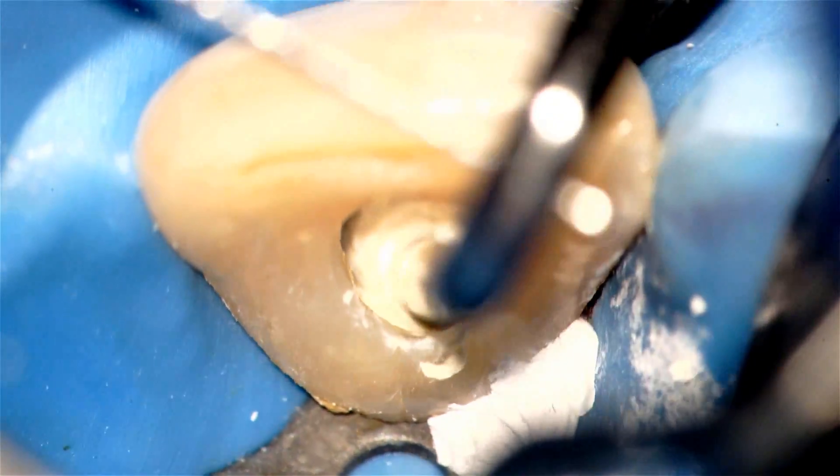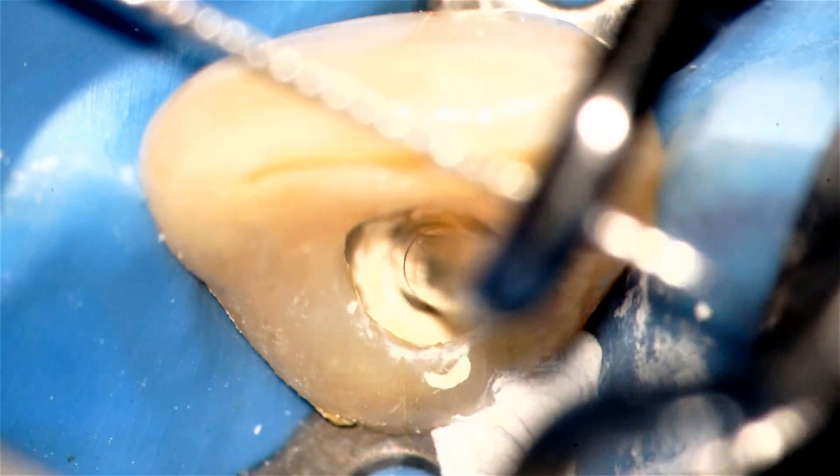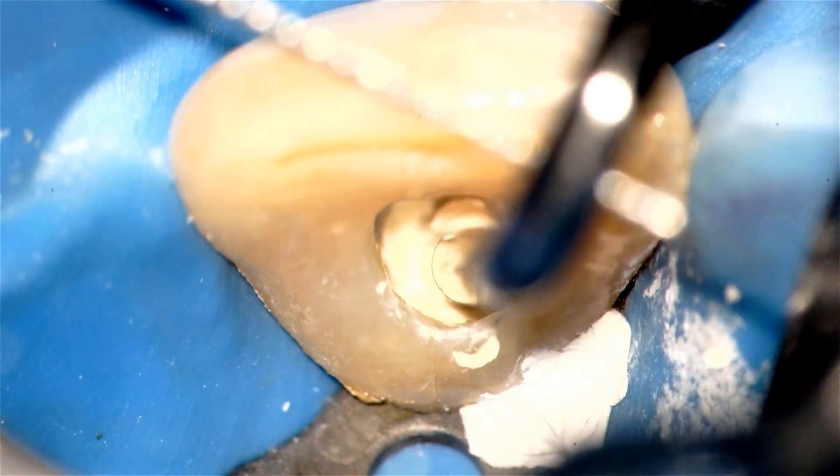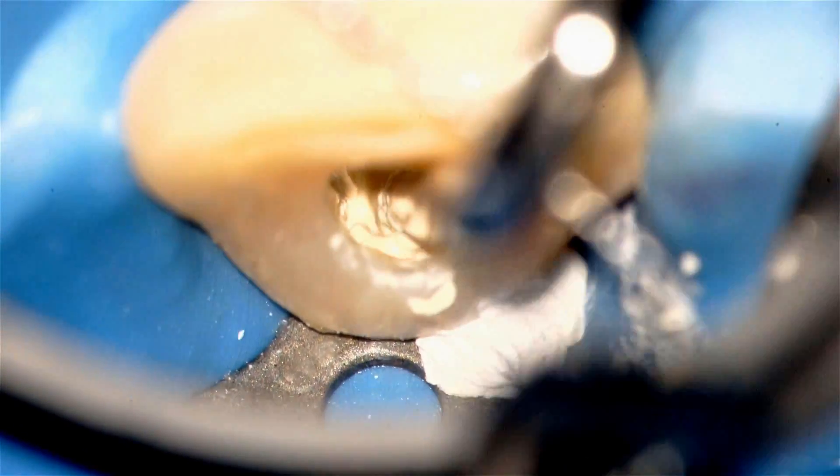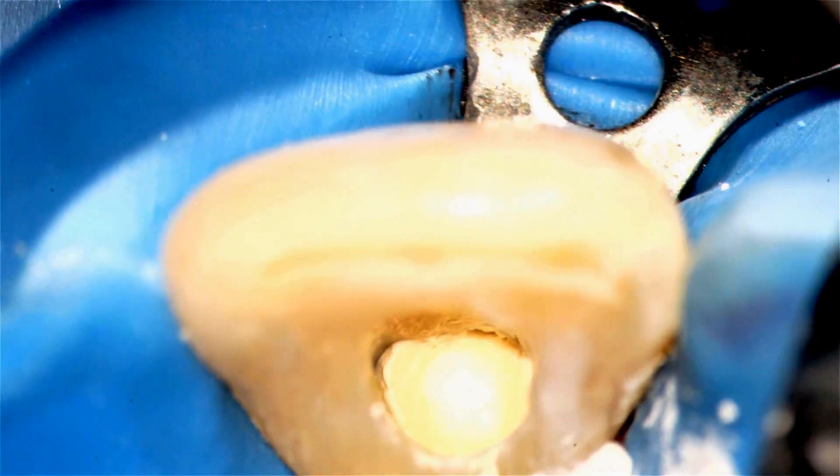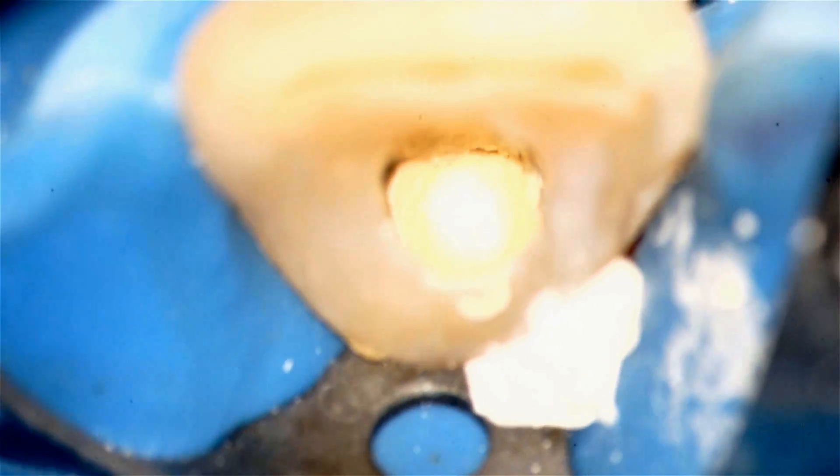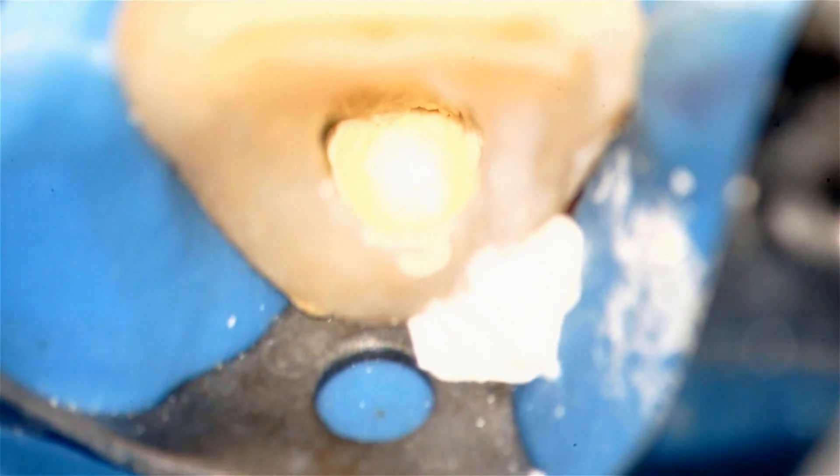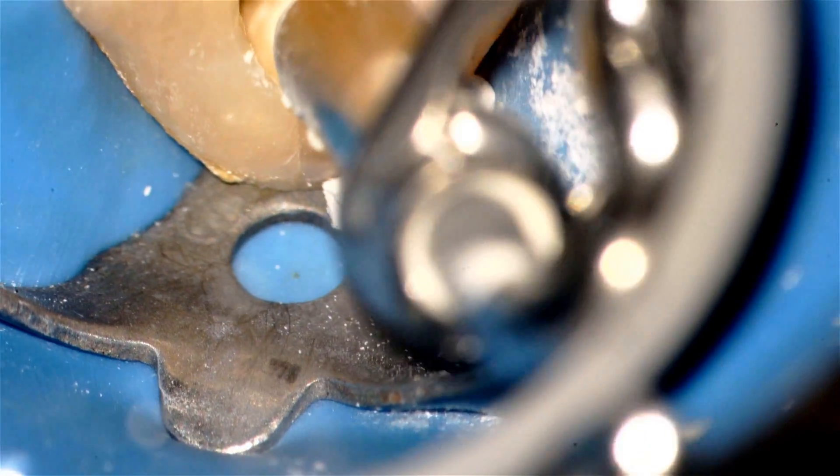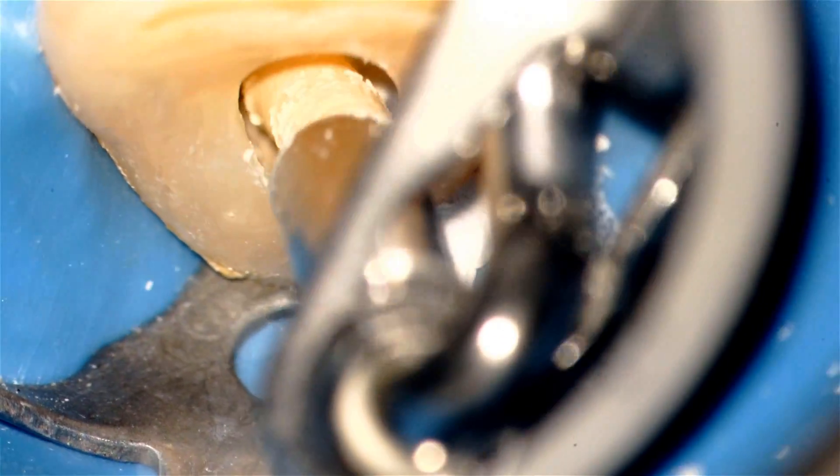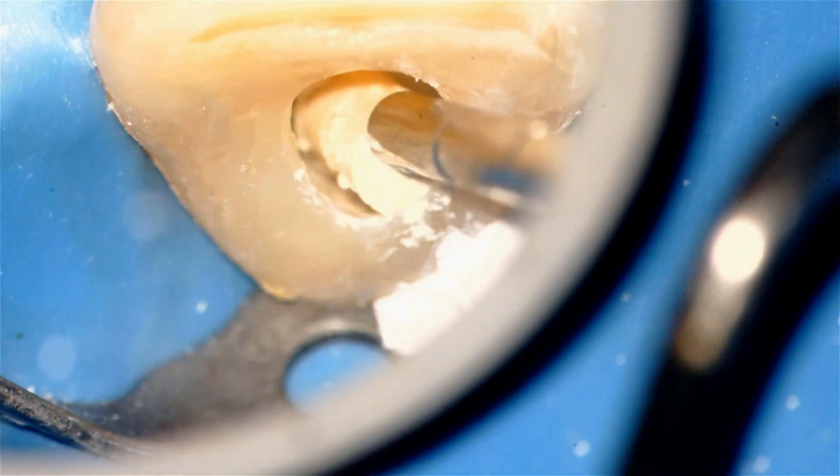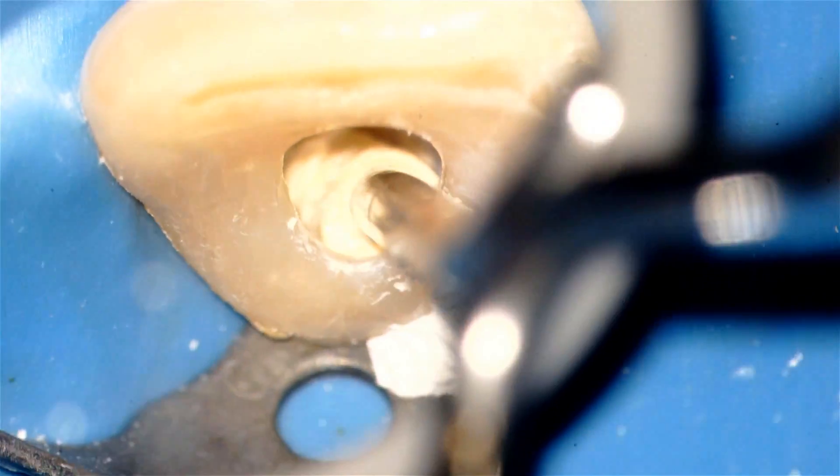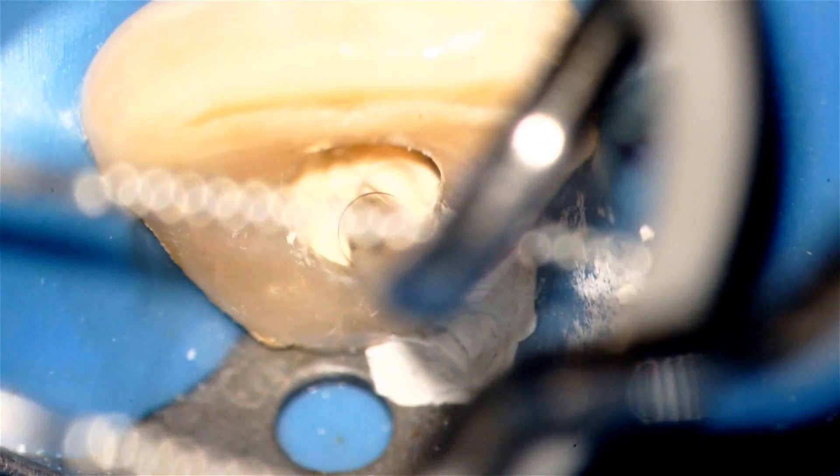So this is an ideal material if there's periodontal communication. So I apply the Biodentine made by Septodont with an amalgam carrier, and I press it down with the large number 12 shoulder plugger in this case. And then I have my assistant apply an ultrasonic file against the side, and I activate it with my foot to activate ultrasonic energy, which causes the Biodentine to flow into the crypt and into the resorption defect.